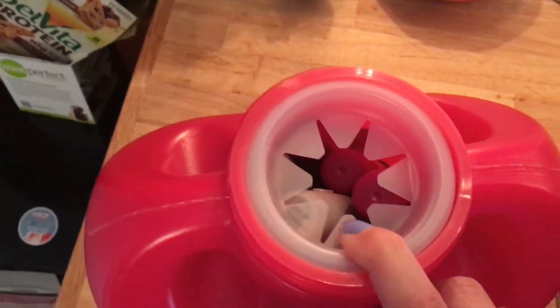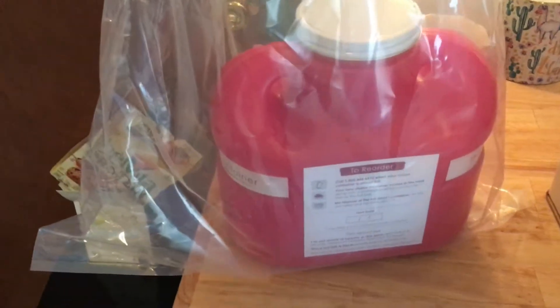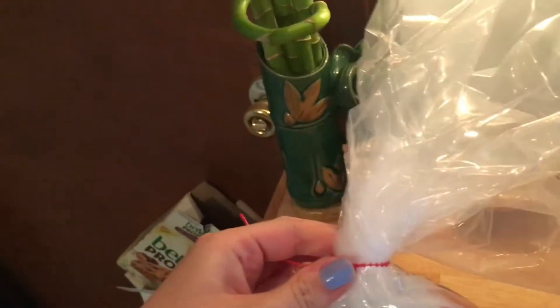This is my sharps container that's completely full — I can't jam anymore in there — so I'm going to put the lid on it. The full sharps container goes in this very durable bag. Now I'm going to seal it. The tie is actually taped to the lid — it even says so in the pamphlet. I'm going to twist this plastic bag really tight and secure it with the tie.